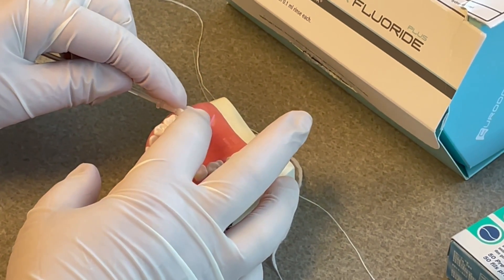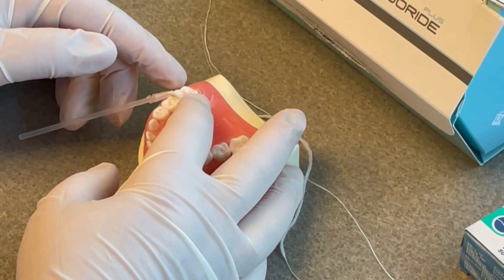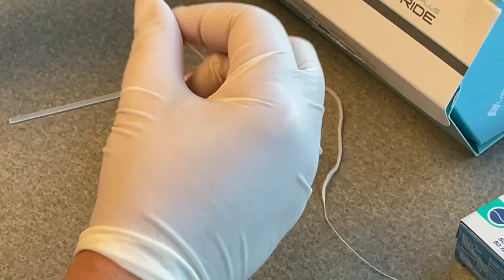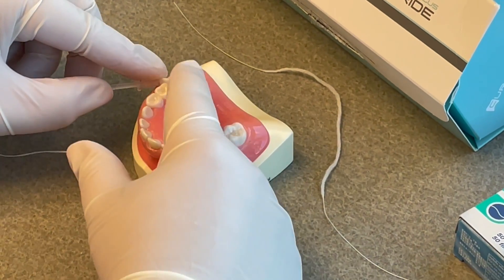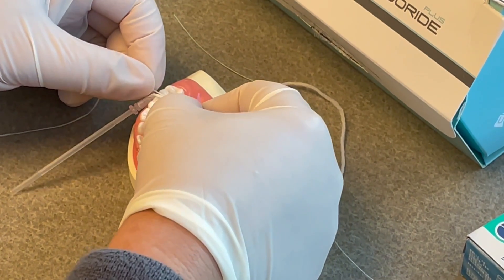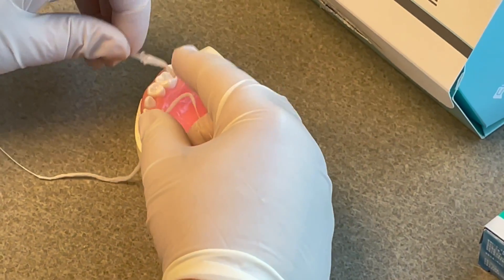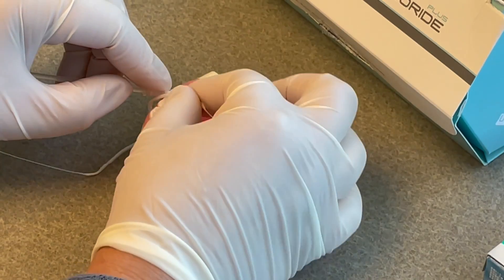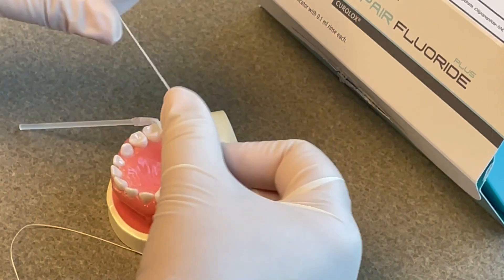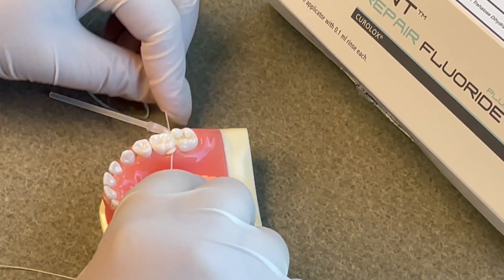If there's space, you could try to floss it between there, but typically there's a contact, which is why they're getting incipient caries. Just lay it up there. Normal floss is so skinny that it won't necessarily help push it in there. I have found that using super floss, which is thicker and puffier, is more effective. Line it up in there — there's your puffy floss — and just push it down into the contact. You probably have an assistant helping you do this.